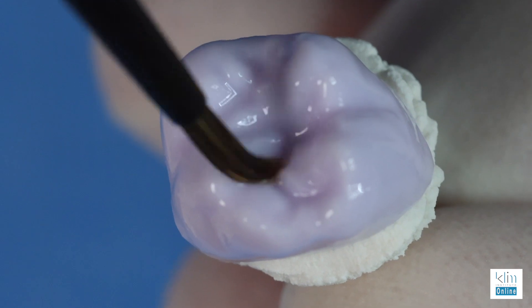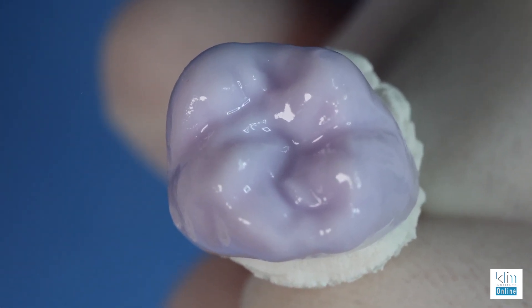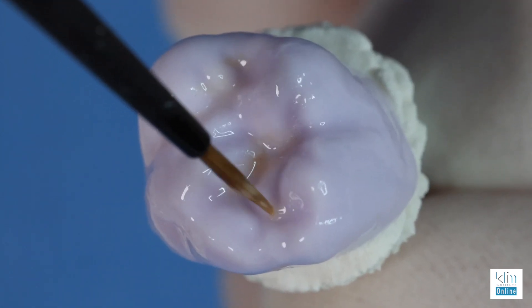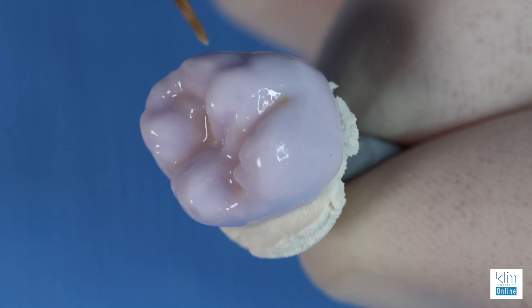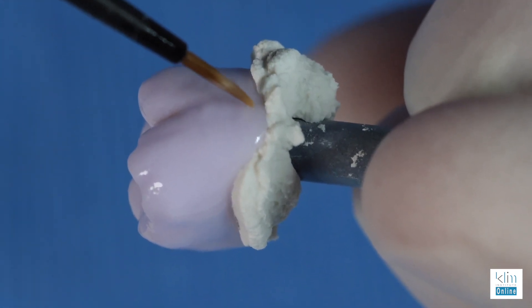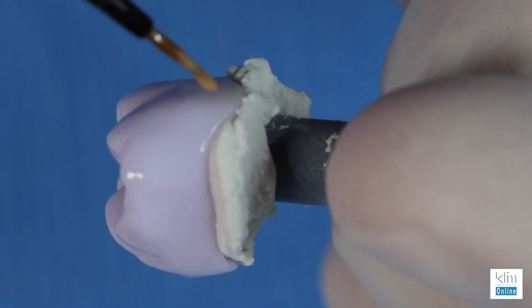That will interfere with our color saturation. We're going to add some dentinal warmth — you don't want puddling in that area. Our next step is to take the cervical collar, which is the dentin, and apply. Lightly dab it into the depths of the grooves and pits and you'll see it just blend and feather out. Considering the external grooves as well, this provides a really natural look — it is subtle, it's going to look great. On the cervical zone, if you need to highlight more of a cervical saturation of the dentinal shade, you want to feather that from the margin into the mid-body area.